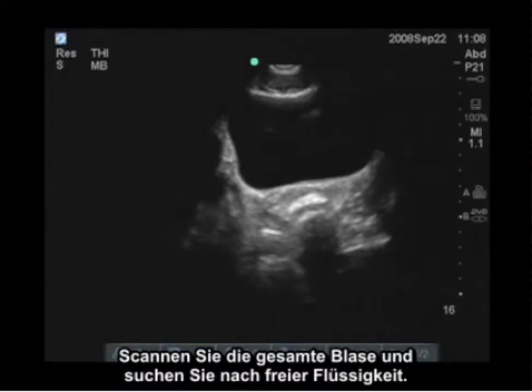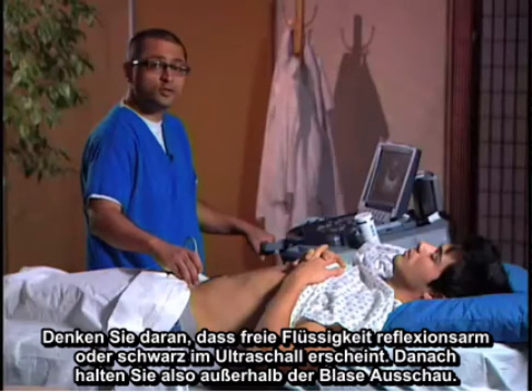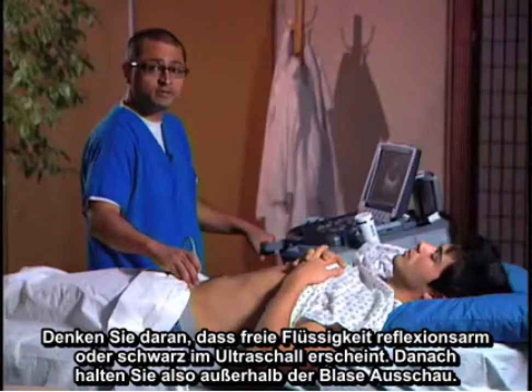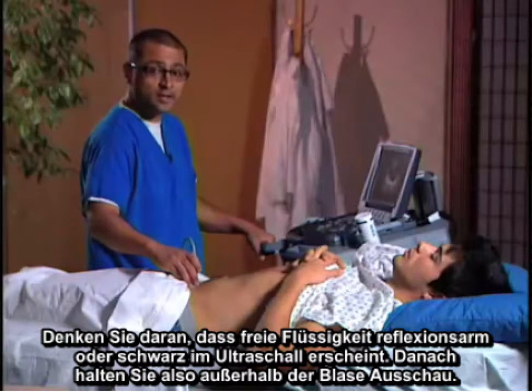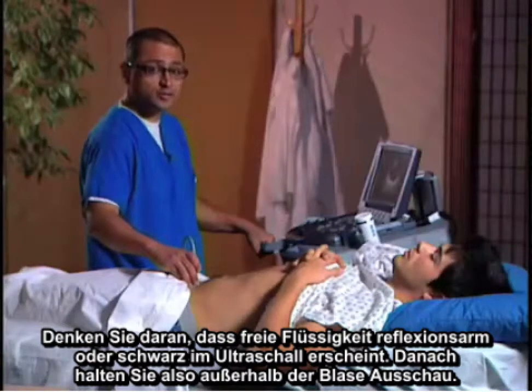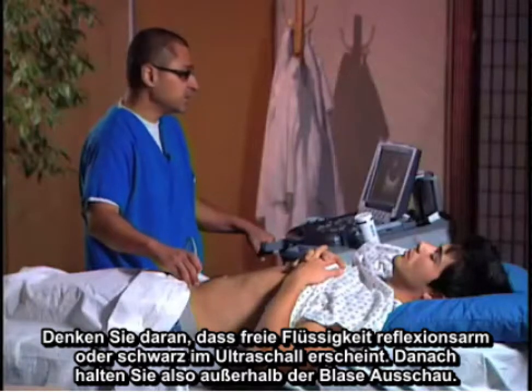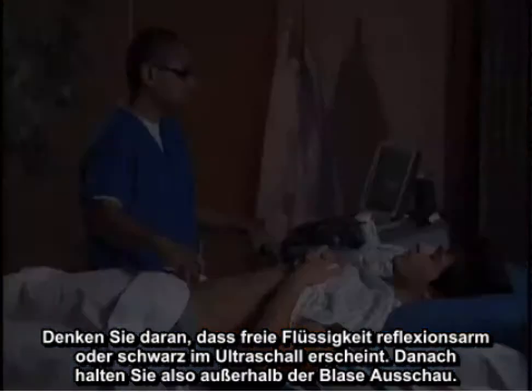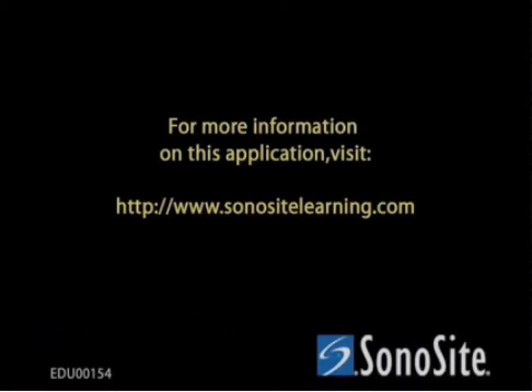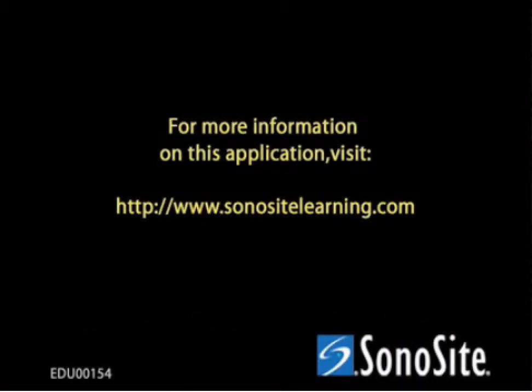As you're scanning through the bladder, you're looking for free fluid. Remember, free fluid is anechoic — or black — on ultrasound, so that's what you're going to be looking for outside of the bladder.